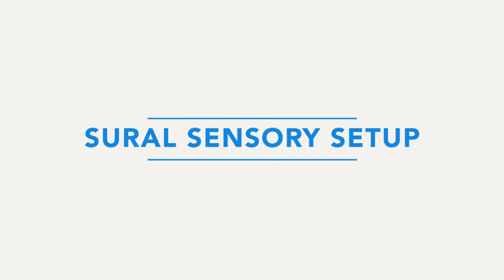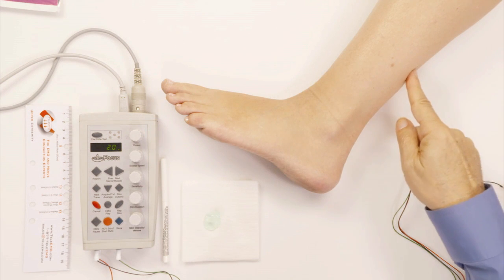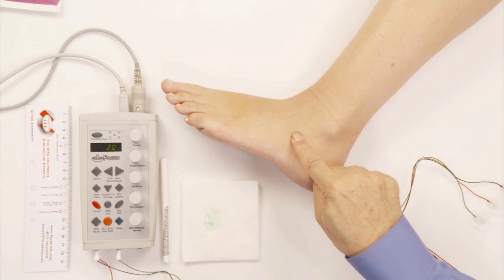First, let's start out by looking at the sensory nerves. Typically we study one sensory nerve in the lower extremity, and that's the sural nerve. The sural nerve comes from the back of the calf and goes around the ankle.